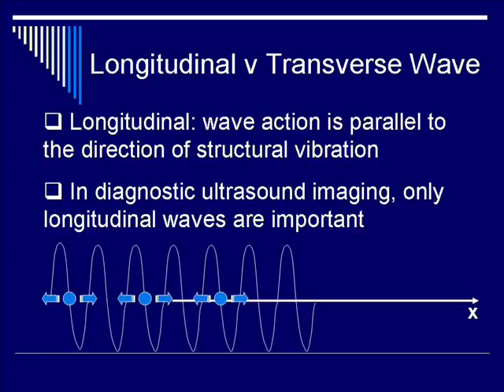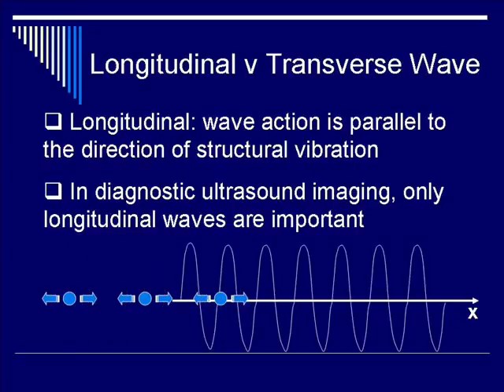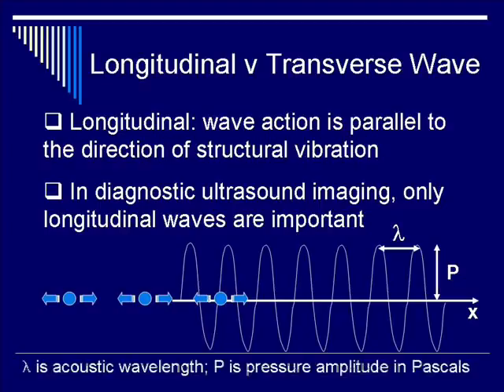On the other hand, the sound waves propagate going from left to right, and therefore they are termed longitudinal waves because of the same direction. On the other hand, for transverse or shear waves, while they're in theory possible, they're certainly not useful in the transmission of ultrasound in the body tissue. They can be understood as having the medium, the molecules, vibrating inside and outside into the paper, with the sound waves going left to right.